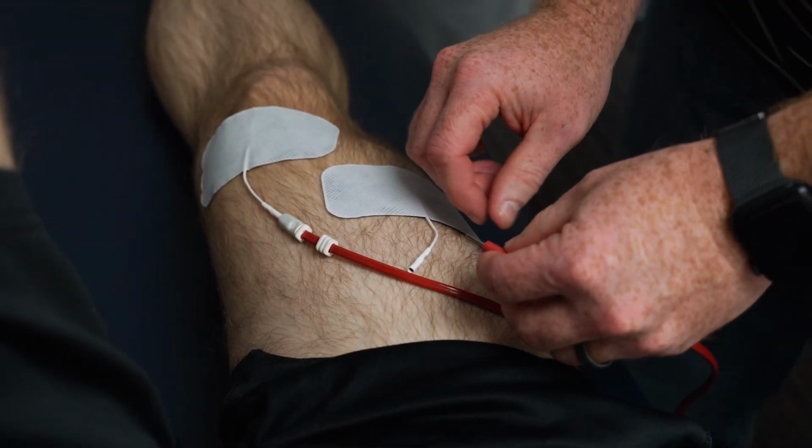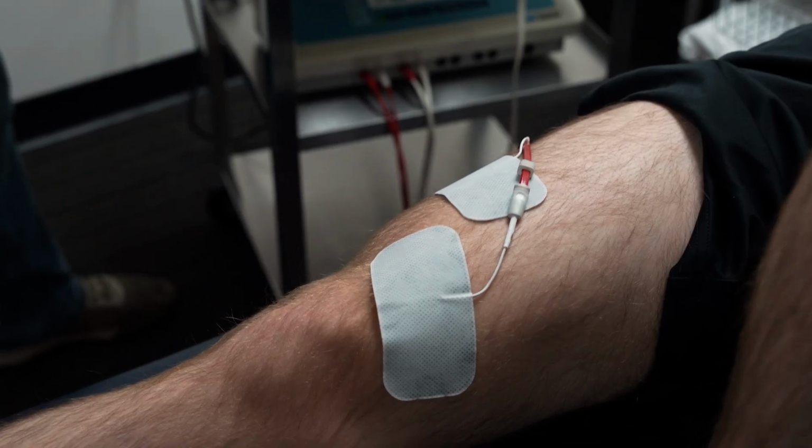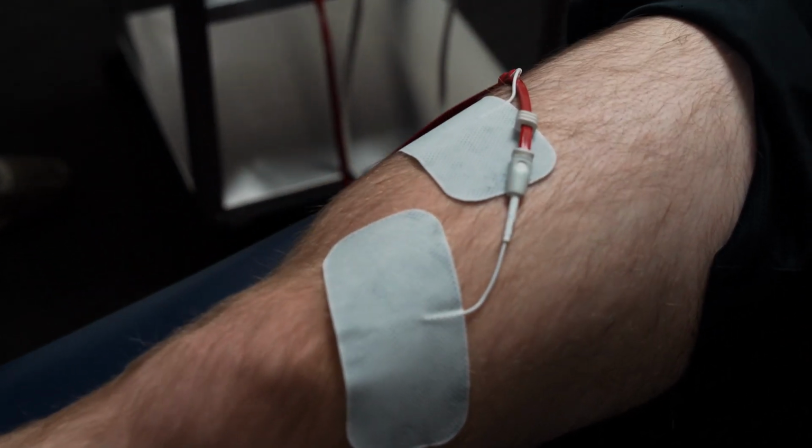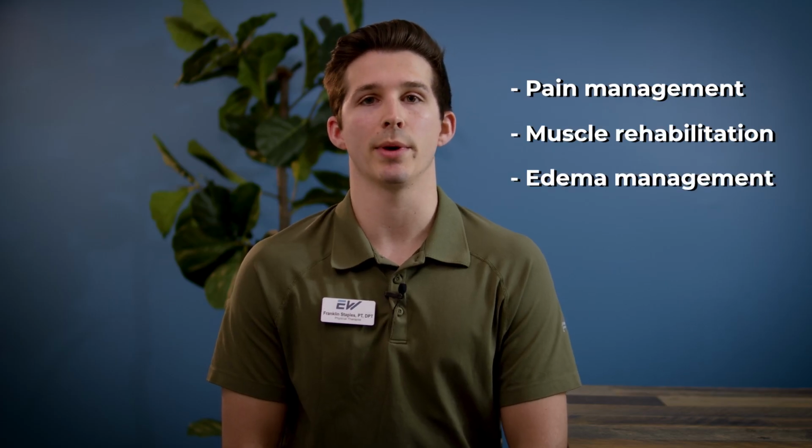The other form is NMES, which stands for neuromuscular electrical stimulation. And this helps stimulate muscle fibers to help encourage muscle strength or encourage muscle control of a muscle group that might have been lost from any kind of damage to the nerve. Electrical stimulation can be used for pain management, muscle rehabilitation, as well as edema management.